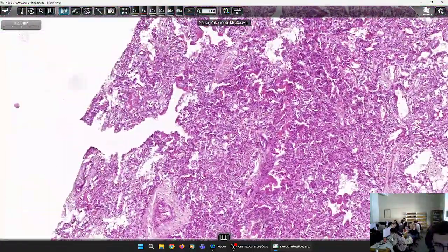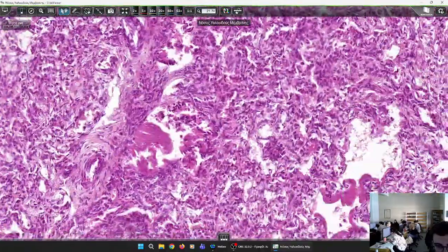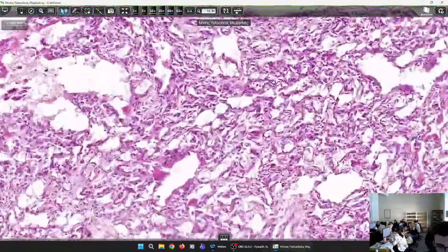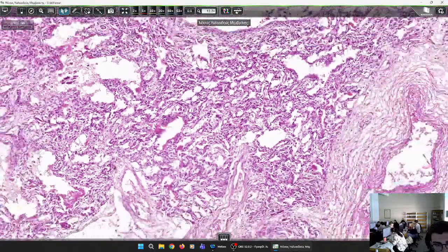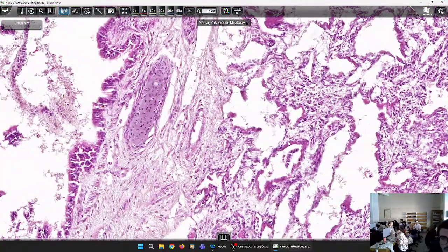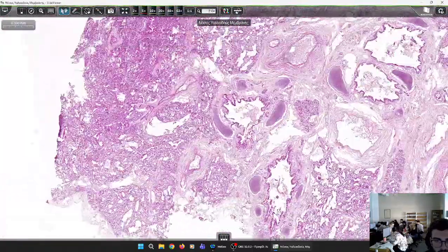However, there is a large variety of causes of the respective lesion in the adult. Septicemia may turn to ARDS. Severe trauma may also lead to it. Suffocation in water, drowning, can also cause this to the alveoli. But if the patient manages to survive, the whole organization of the destructive tissue will lead to fibrosis.